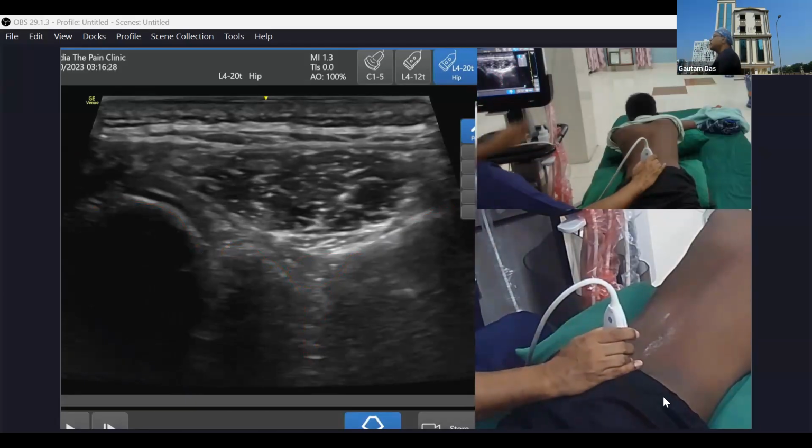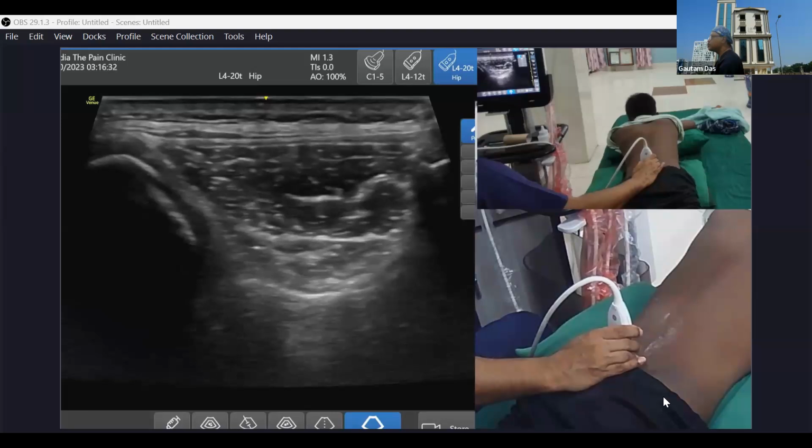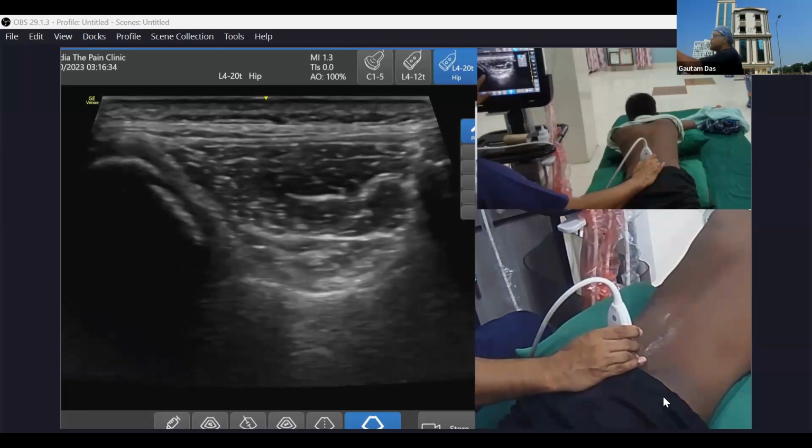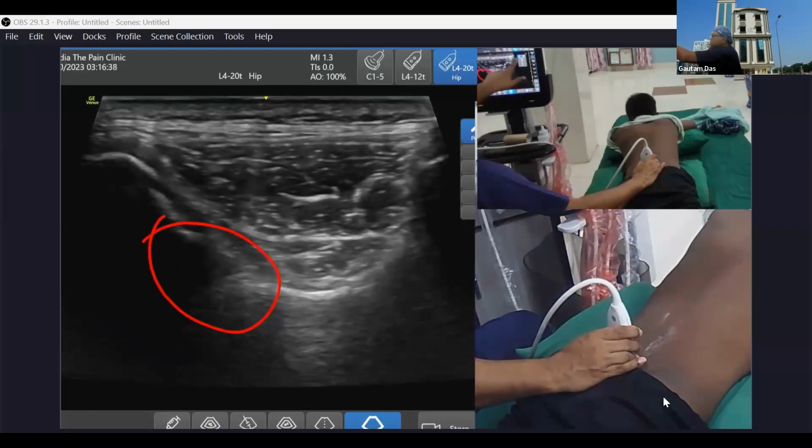So again, I was here initially, at the posterosuperior spine. This is a bony break, the SI joint. This is your fibrous part of the SI joint. This is your spinous process or medial sacral crest.